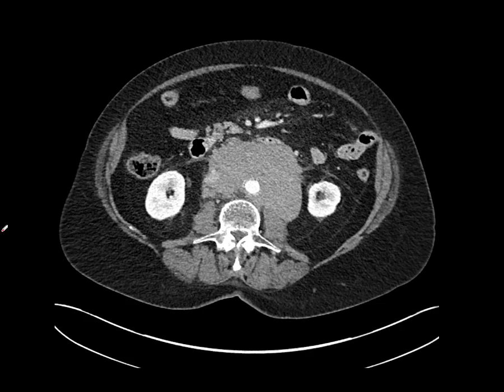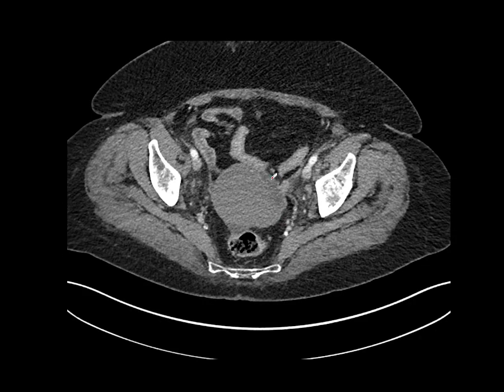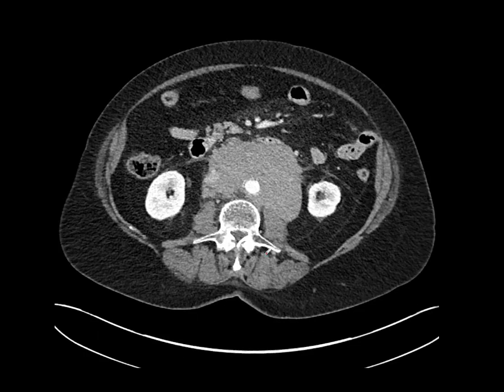This is a patient with lymphoma recurrence. So she had a recurrence of what looks like lymphoma in her para-aortic area, confluent lymphadenopathy. And she also had a pelvic mass, and I thought I'd biopsy this because I thought this would probably be easier than doing a CT-guided biopsy.